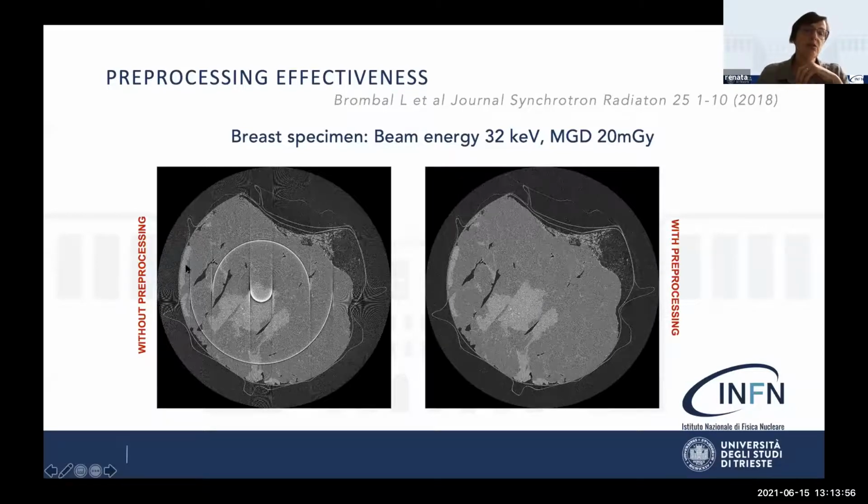So this is an image before, what we can say, detector calibration. This is what our manufacturer usually says when they come to our digital radiology unit, when we call them due to some artifacts that are present in our system.